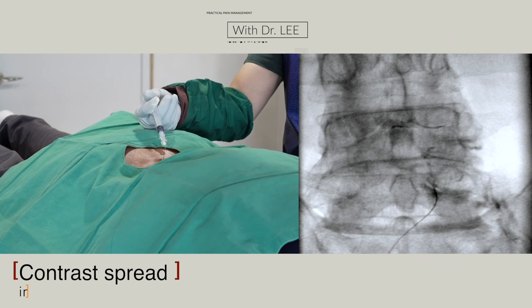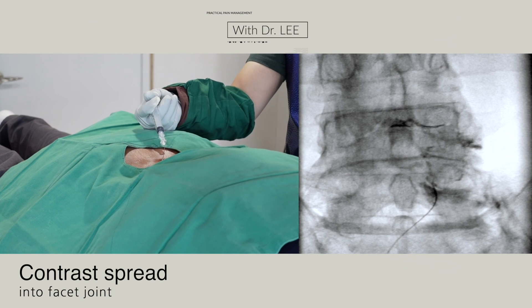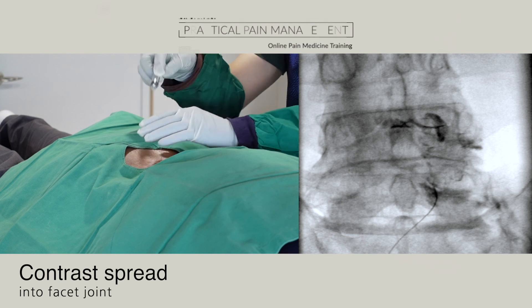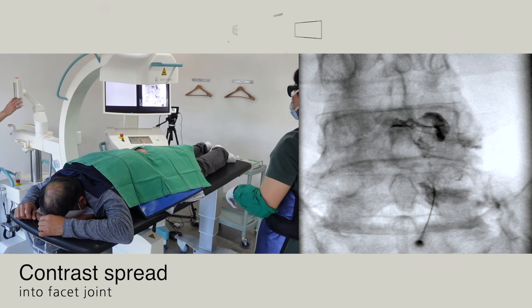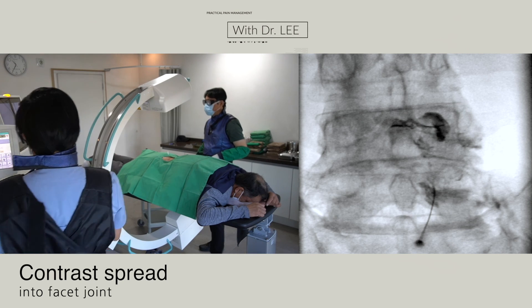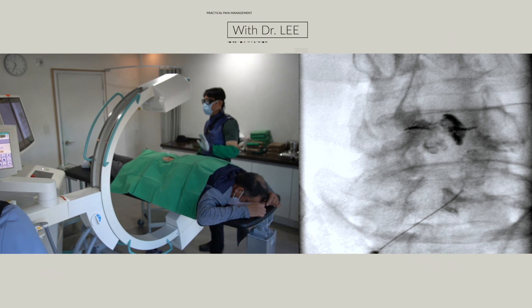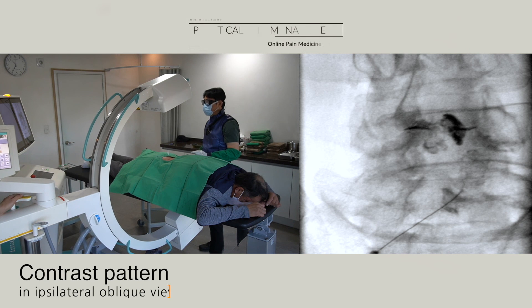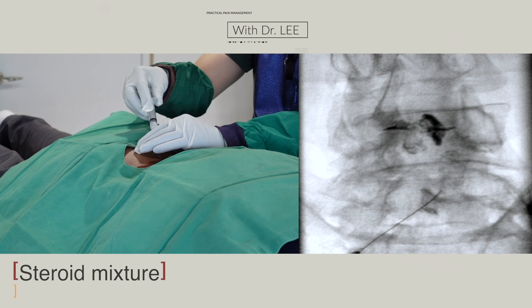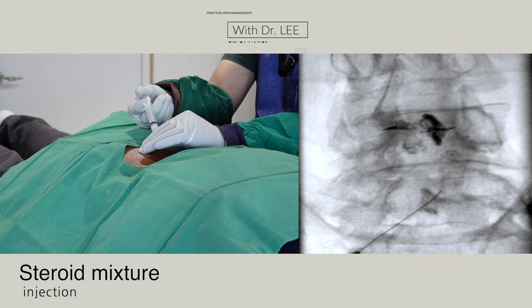Contrast spread into the right L4-5 facet joint. Frequently, joint capsules are ruptured in instability patients. In these patients, contrast spreads into the epidural space and into the laminar space of L4-5. Contrast pattern in AP view. Steroids mixture injection.